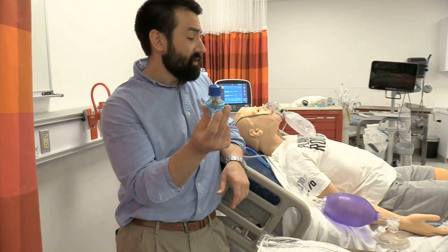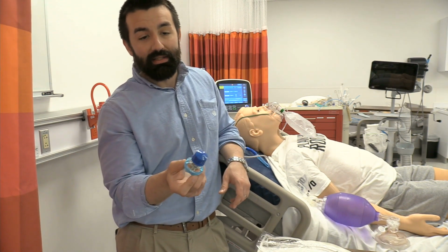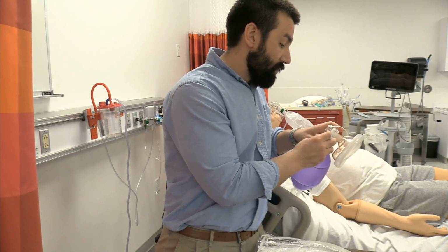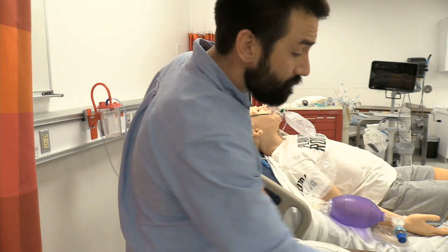A PEEP valve for your resuscitator bag, this isn't a requirement for everybody, but if you do have somebody that's got a significant amount of refractory hypoxemia, not a bad idea to go ahead and place that on the expiratory side of your resuscitator ahead of time. If not, you can always pop it on afterwards.